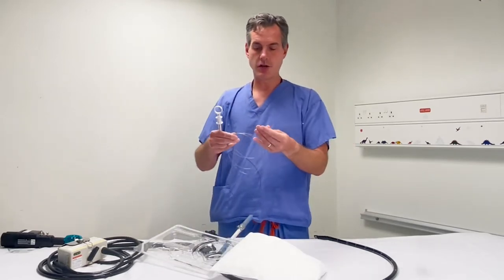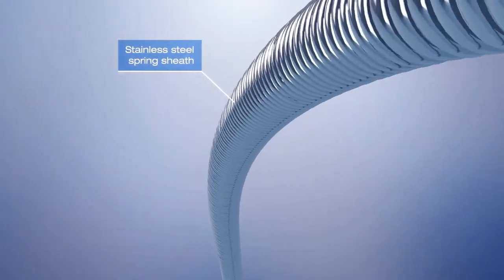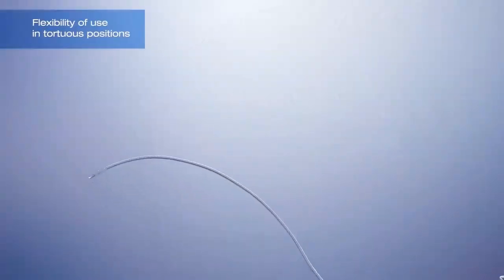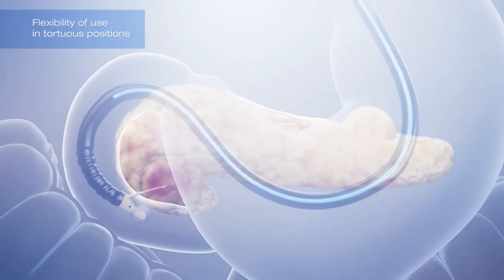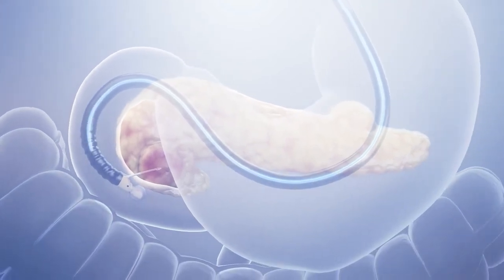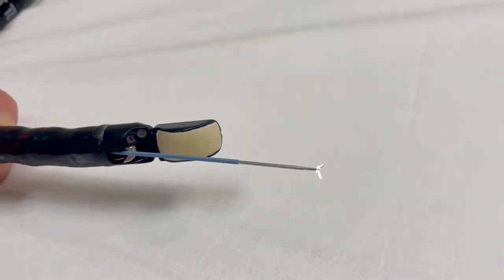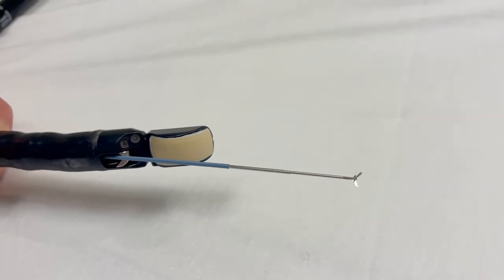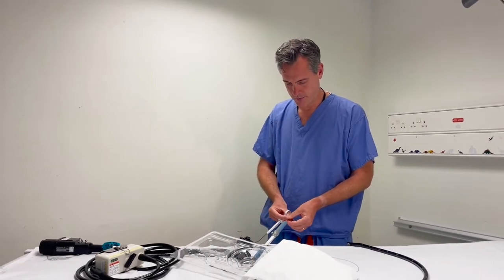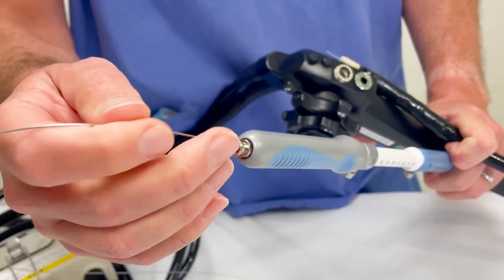One feature you notice as you get them out of the box is just how flexible these are, so they really do act on the bridge and can go down even a tortuous endoscope. Just to demonstrate the action of the jaws — you probably won't see that on the video but they open and close nicely. So make sure that your Moray is closed before it goes down the channel of the 19-gauge needle.